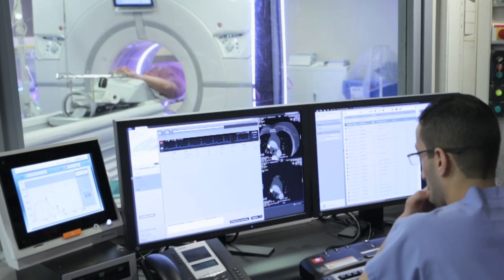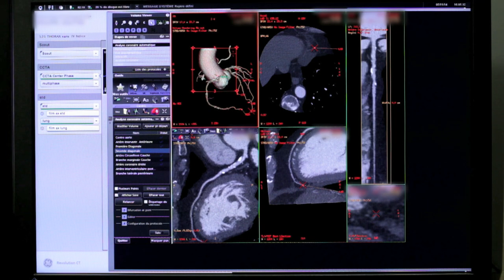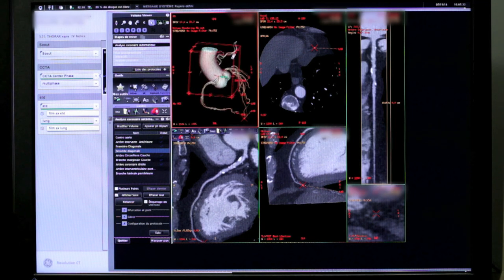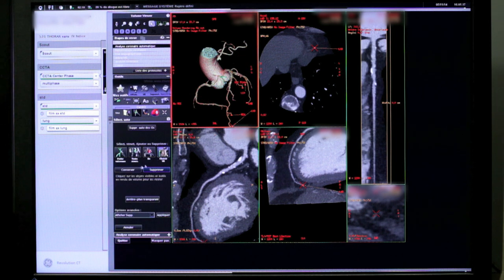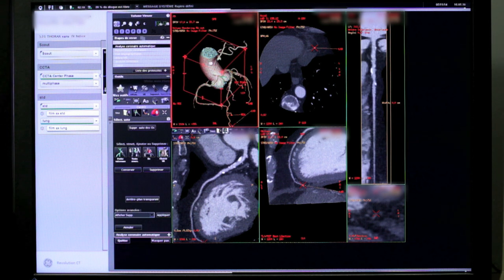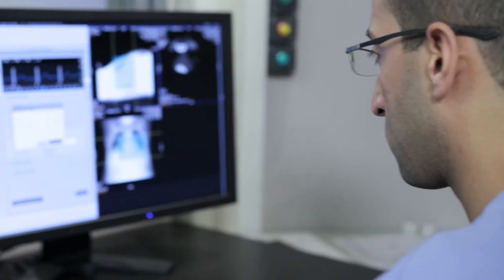The Clarity operator environment supports you with instantaneous access to images as they reconstruct and by automatically pushing them to viewing stations for your review. You can also post-process the images directly on the Clarity operator environment without interrupting your patient workflow, thanks to the multiple session capabilities.